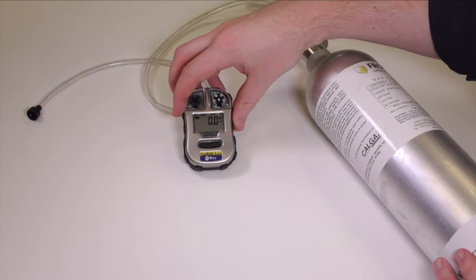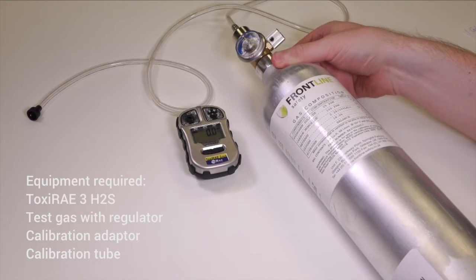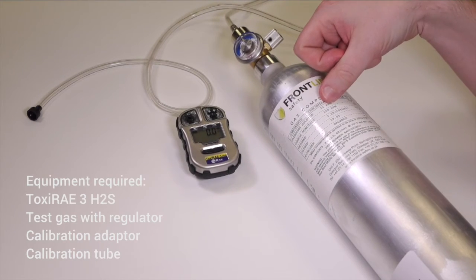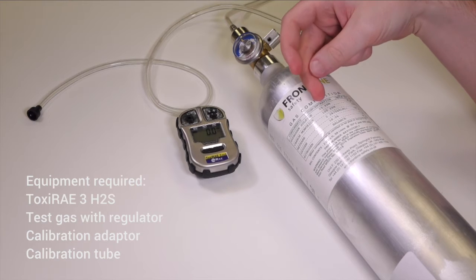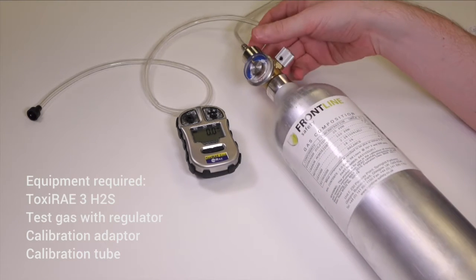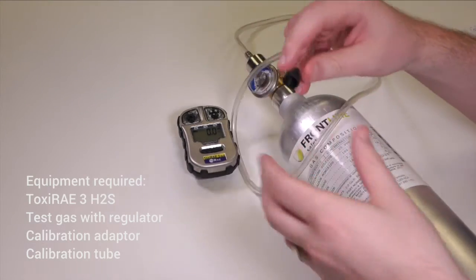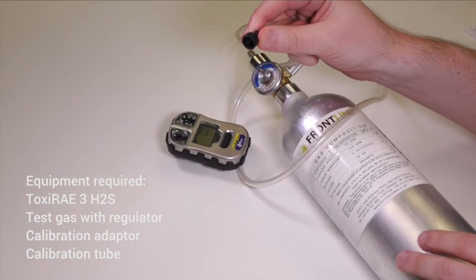So to calibrate manually you'll need the ToxiRAE itself, the cylinder of gas which should have the known concentration of H2S in it, in this case 25 ppm, you'll need a regulator as well, calibration tubing, and the calibration adapter which comes with the unit.